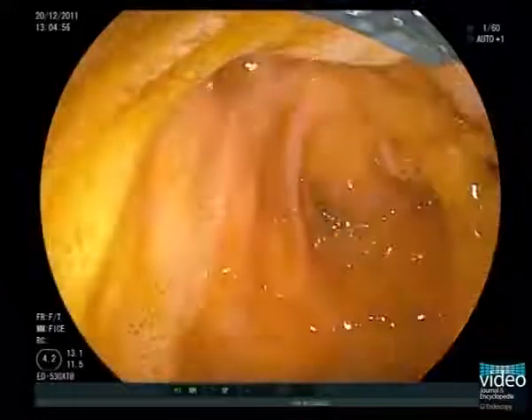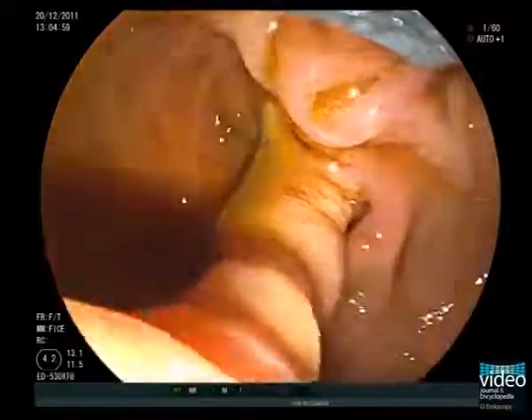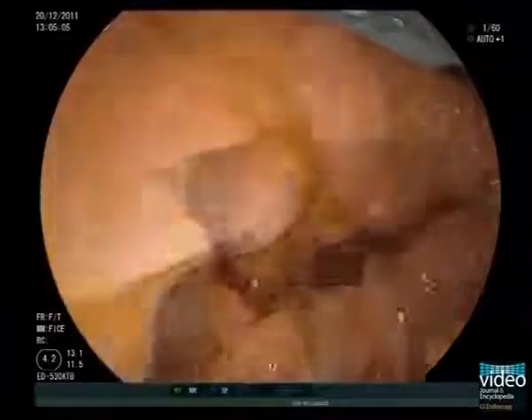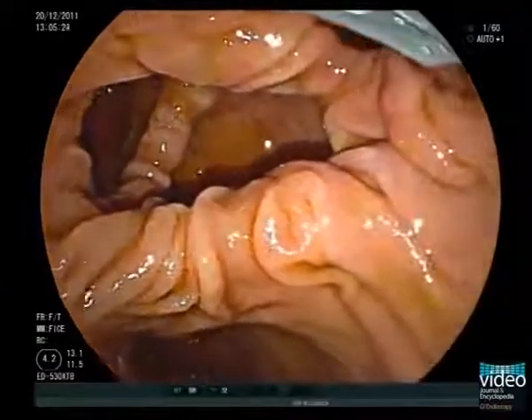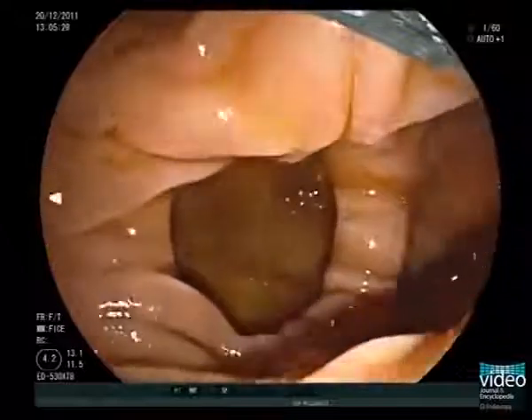Now let's look for the papilla. We carefully cannulate the sac with the tip of the duodenoscope, and here we see a confusing number of little holes and cavities that might be confused with papillary openings. In this situation, keep in mind that in the vast majority of cases, the papilla is located on the lower rim of the diverticulum or just inside, somewhere between 4 and 8 o'clock.